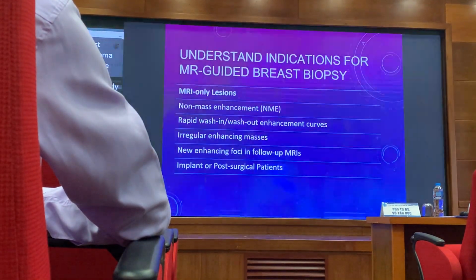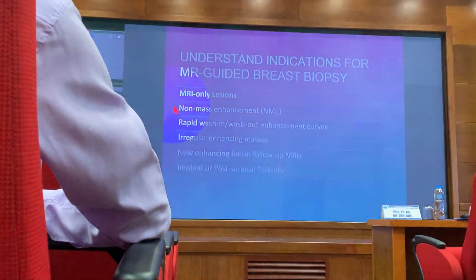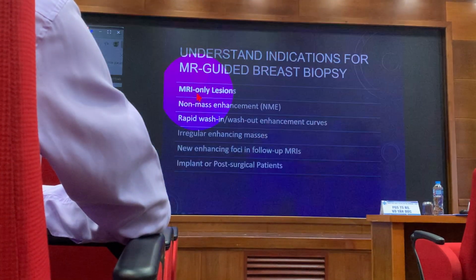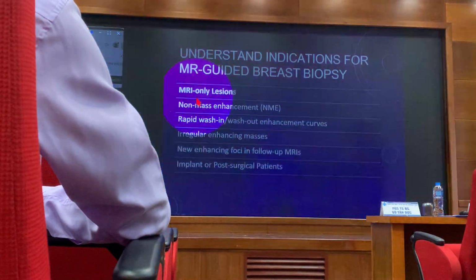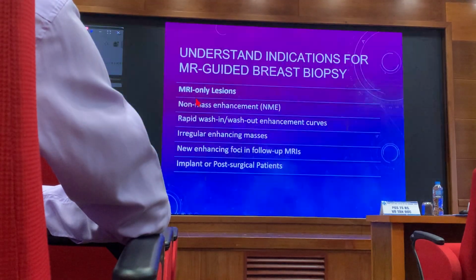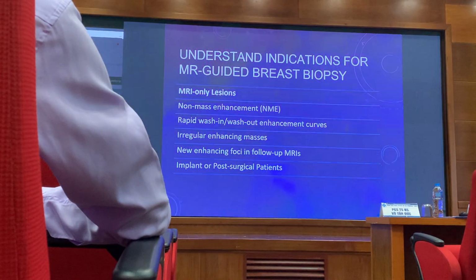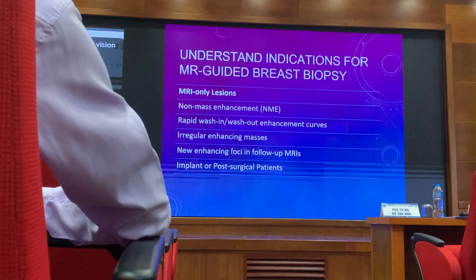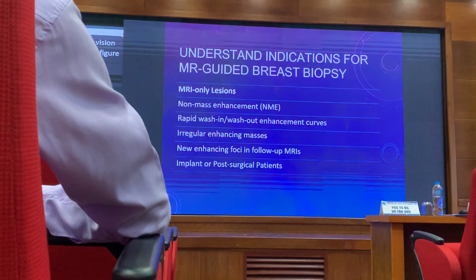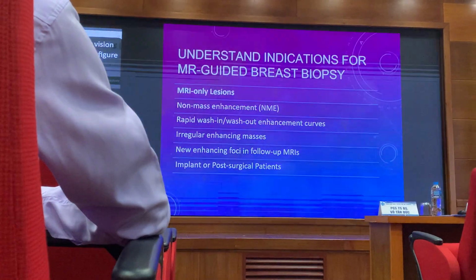The only thing is that we are only able to diagnose the lesion under MRI. So this is the main point if you want to do MR guided breast biopsy. Because in medicine, whatever lesion we detect, if we can figure out early whether it is malignant or benign, and then we do treatment, the survival rate for the patient will be higher.